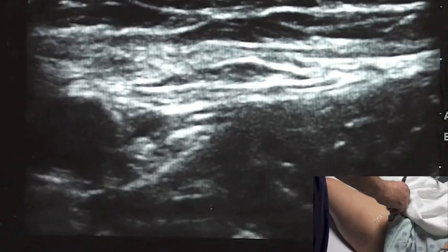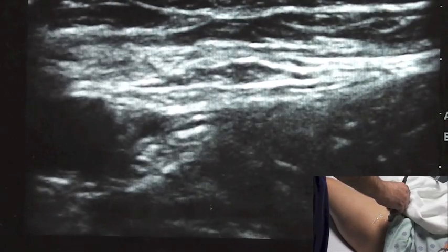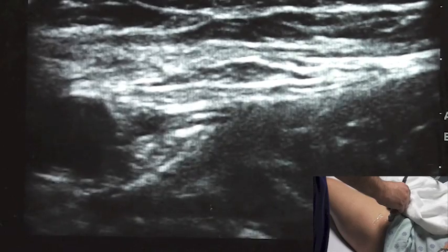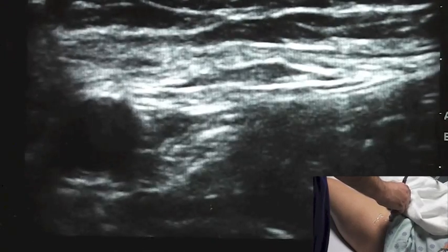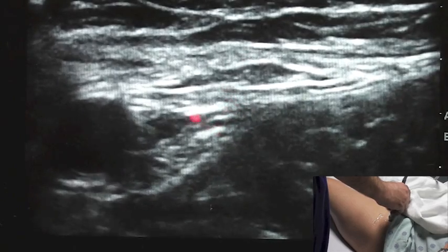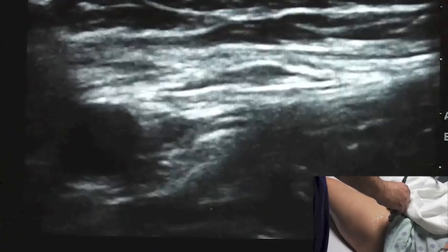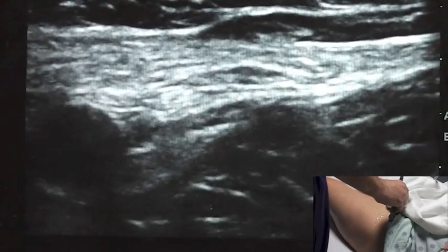Currently we are using 0.5% ropivacaine, though that has changed from time to time over the years. Very important when doing this block — as with any block — aspirate prior to injecting. In this instance, our biggest concern is that we're very close to the femoral vessels, and we want to avoid an intravascular injection.